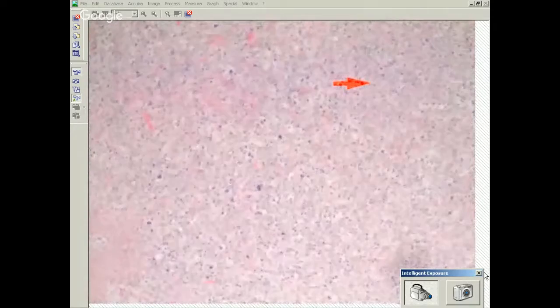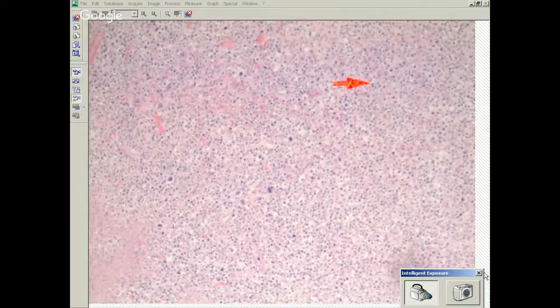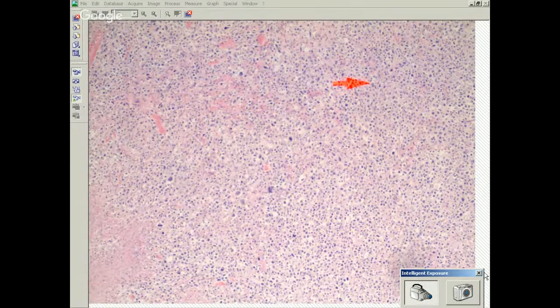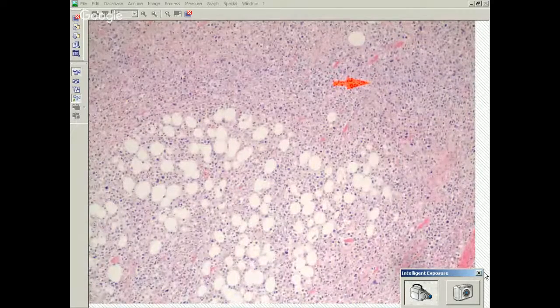So what would your differential be here? Could be. Well, MALT lymphoma is usually more bland, right? It's usually low grade. So if it was a MALT lymphoma, it would be something that maybe transformed and became like a diffuse large B-cell lymphoma. You know, I think that's a possibility. It's an aggressive big lymphoma, right? Okay. So this is a very aggressive looking lymphoma in the small intestine.